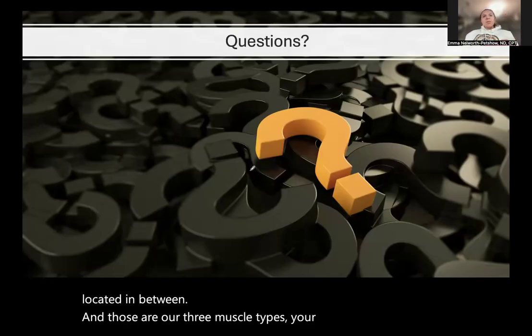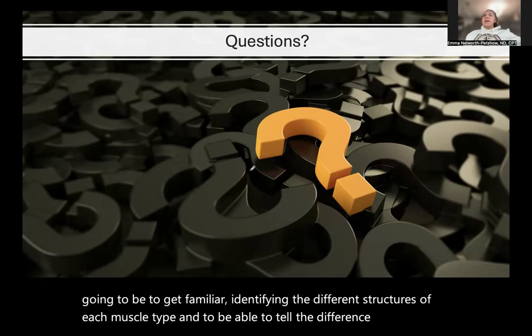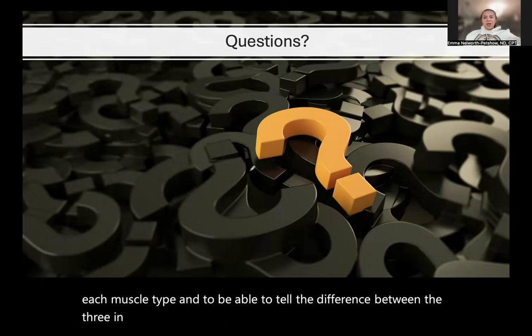Your goal for this week is going to be to get familiar identifying the different structures of each muscle type and to be able to tell the difference between the three in their shape and their structure and their function.